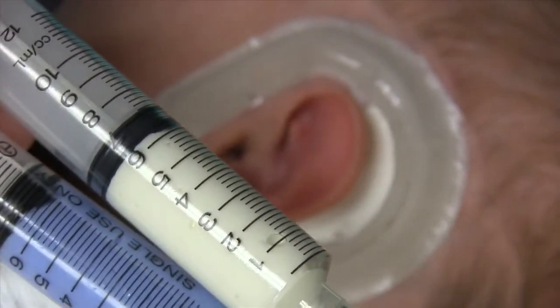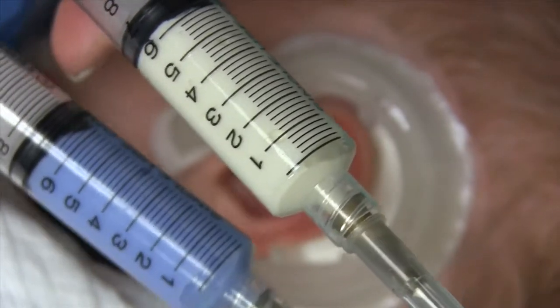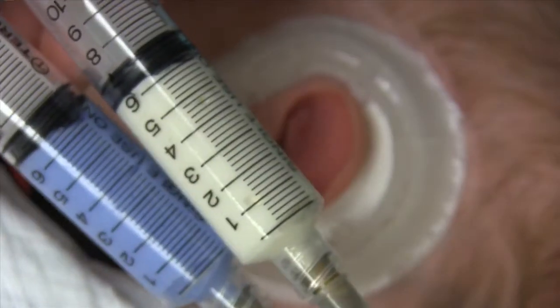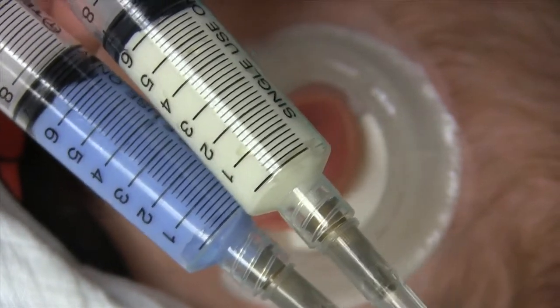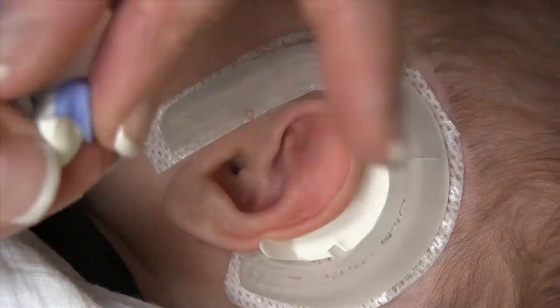Now I'm going to take my moldable silicone impression material. The product that we use comes in two separate packets and we put them in syringes so that we can take a little bit at a time and mix it together. When you mix it, it starts to form the compound and starts to harden in just a few minutes.